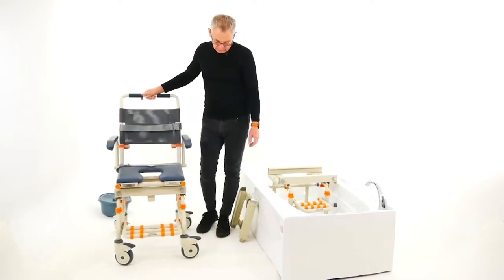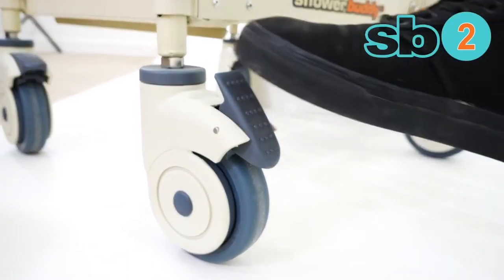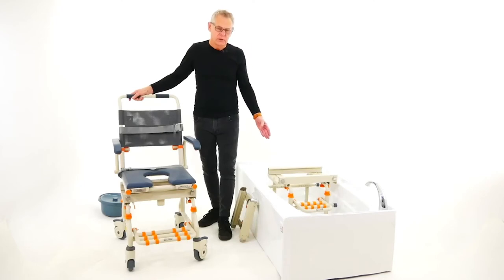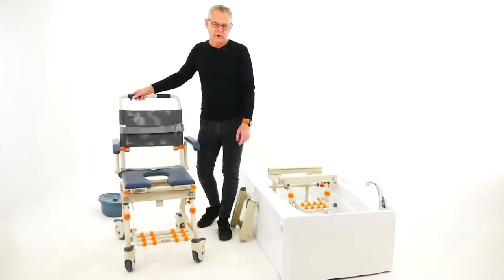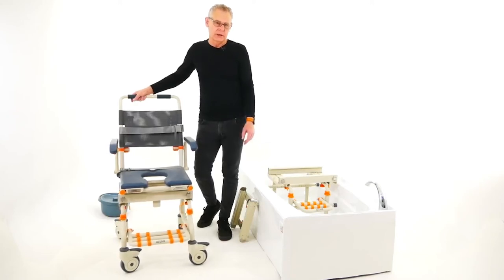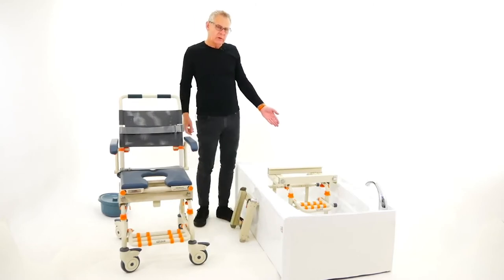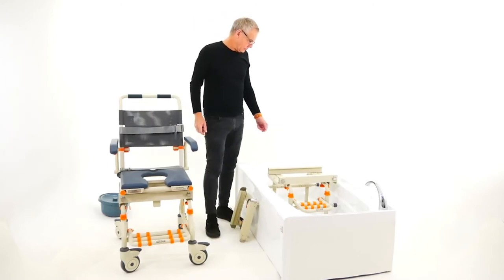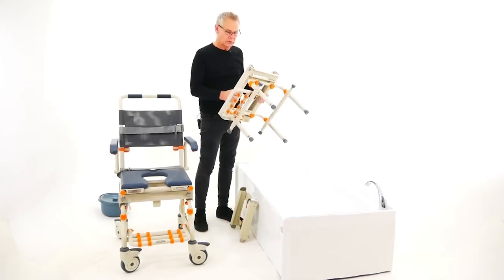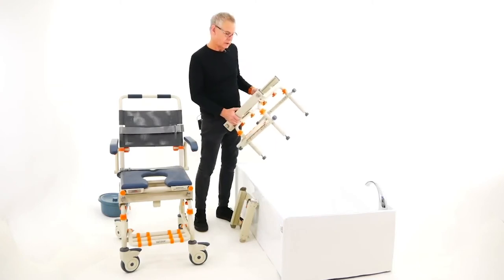The caster wheels are all 5-inch, 125mm wheels — all locking. The chair is fully height adjustable, as is the bath base, in 1-inch or 25mm increments, so the chair can be adjusted to suit pretty well all bathroom situations. The bath base is a lightweight aluminum product — very sturdy, very strong — with a lifetime guarantee on the framework, including the chair.